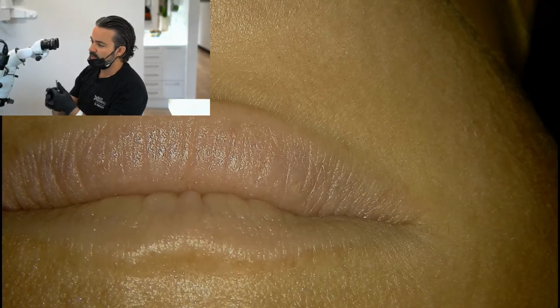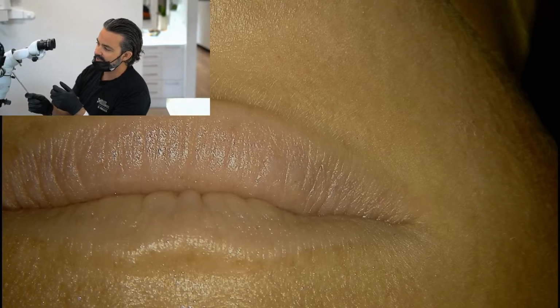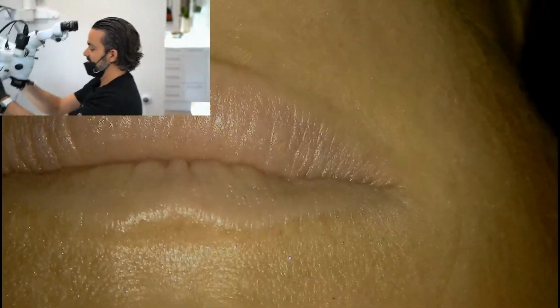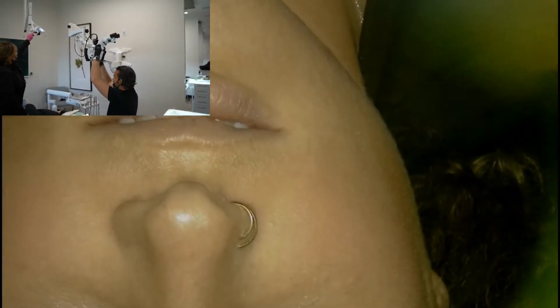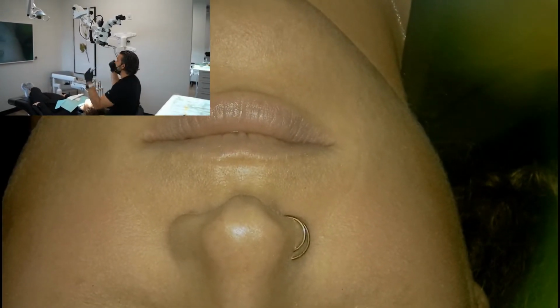So the one advantage of having an adapter, like a beam splitter here with this is, especially with you guys in general dentistry, like I said, you can get this out of your head, and this gives you a lot more depth of field when you're dealing with a digital camera than your own eyes. And so with video documentation, I mean, I can come up as high as I want. And if you look, I'm under this microscope.